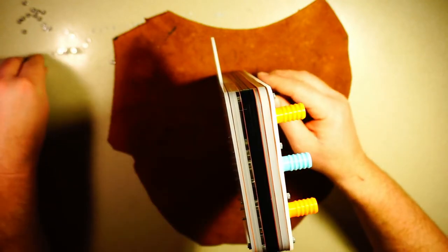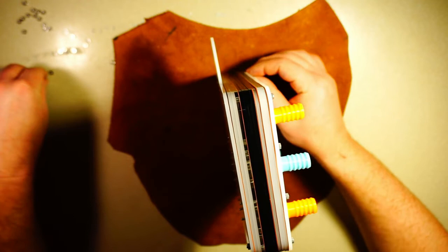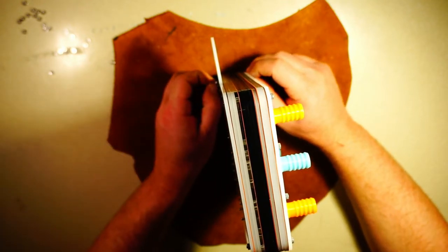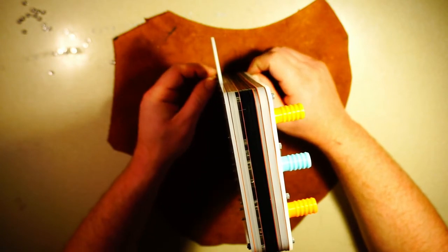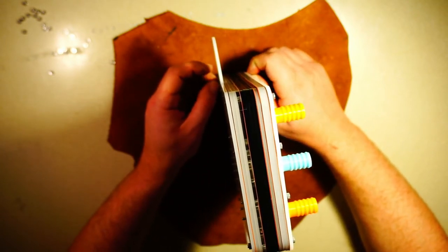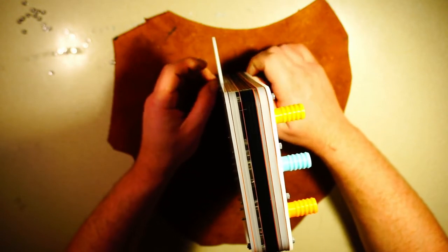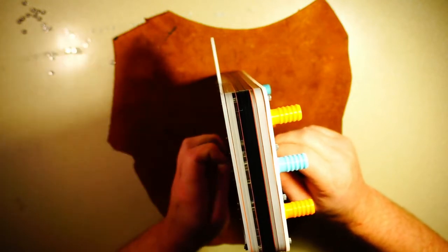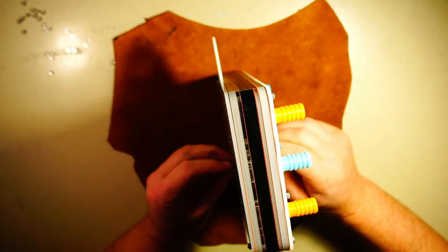So when I put this together, I want to use just finger tight nuts to begin with, and then I'm going to tighten them up a little bit more in a star pattern to keep the gaskets flat, much like an engine head. They don't need very much pressure, but a little bit will seal the valve block.